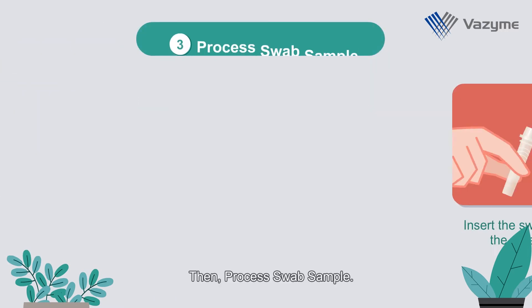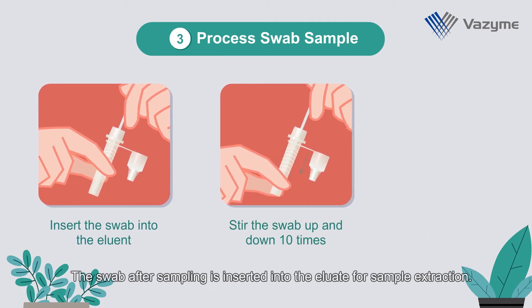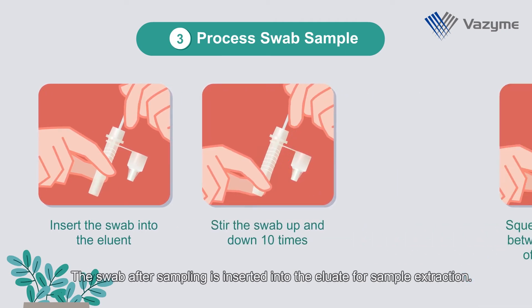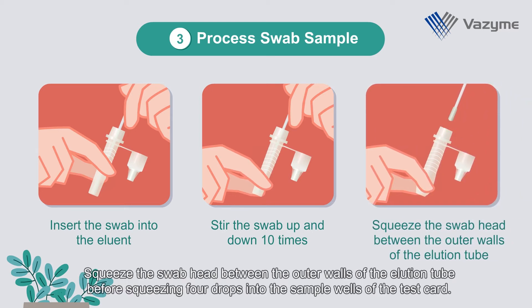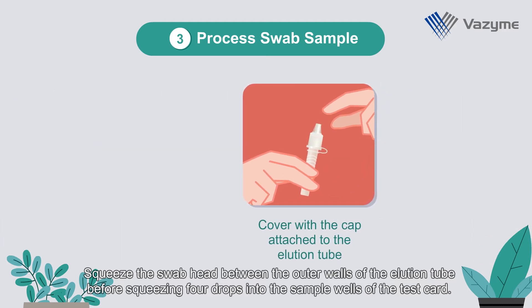Then, process the swab sample. The swab after sampling is inserted into the tube for sample extraction. Squeeze the swab head between the outer walls of the elution tube before squeezing 4 drops into the sample wells of the test card.